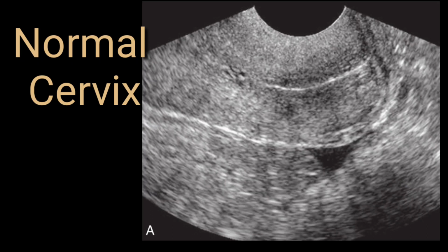Within the cervical canal, you can also see an echogenic line. This is cervical lining. So cervical lining is also visible. On the scanning, you can evaluate cervical pathologies very clearly if you pay attention. So you can find out any pathology within the cervical canal. If there is any problem within the cervical canal, you can find out. If there is any cervical intracanal polyp, you can also appreciate that on the transvaginal scan.